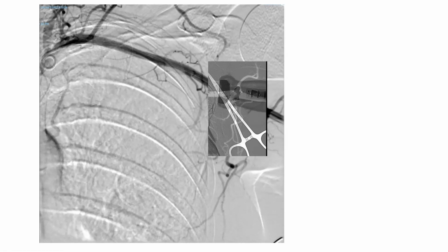I don't like to do live fluoro for several reasons. One, I don't like to fluoro myself and fluoro my hands. Two, it's hard to do live fluoro and live ultrasound. It can become cumbersome. Fluoro can be deceiving because it's 2D images. You want the 3D images. You want the ultrasound value of showing you the vein and the pleura and possibly the ribs if you're too medial. So you want that combination. You use a fluoro to position your probe, then you stick under direct ultrasound.